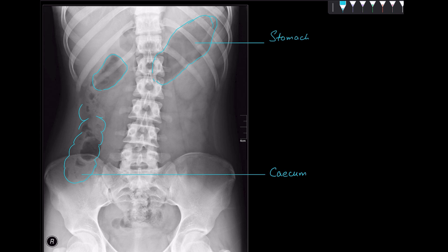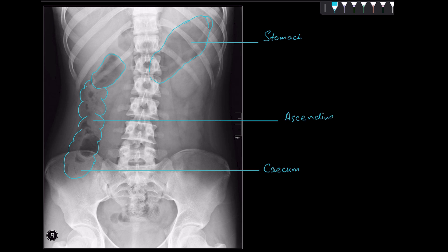These are the haustra — the classical appearance of the large intestine. You can see that this is the ascending colon. At this place, this is my hepatic flexure. I am calling it the hepatic flexure because you can see the presence of the liver here. My ascending colon makes a bend at this point, and this bending part is known as the hepatic flexure.